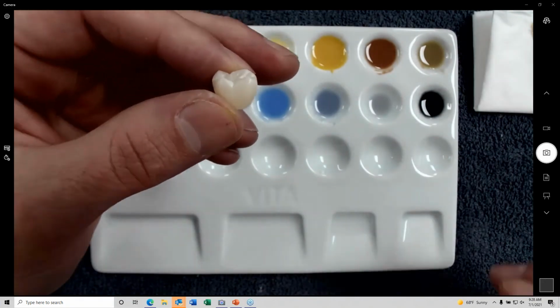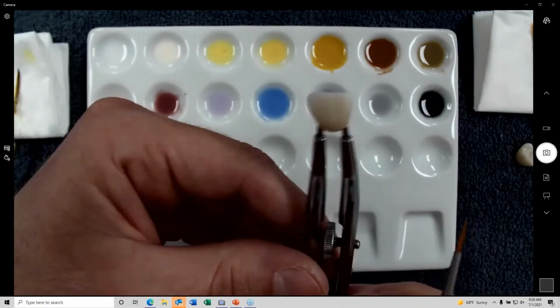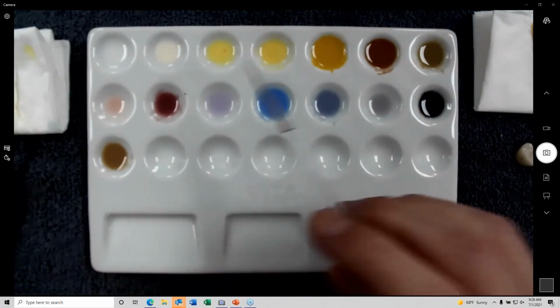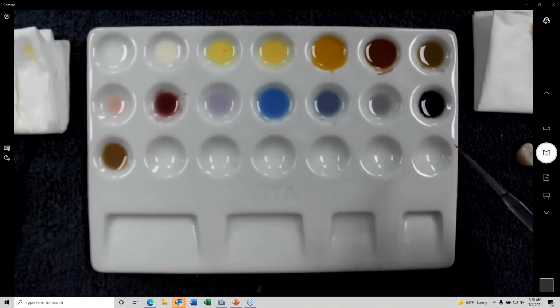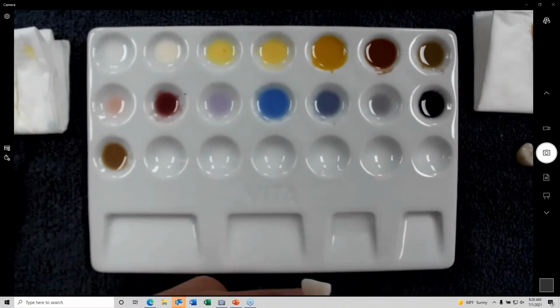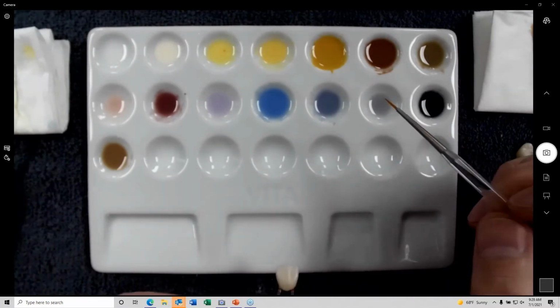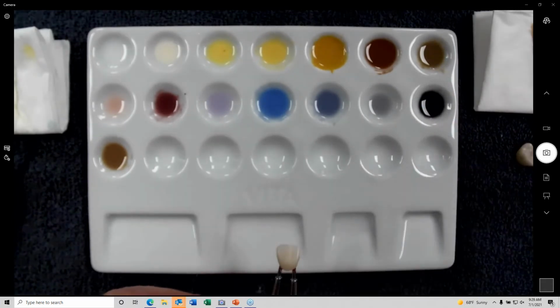It's very important. So, staining a crown, with our stain kit here, and you can see this is our Accent Plus stain kit, and we've got lots of different effect colors here. I don't usually use most of them, or a lot of them. I've got a few that I really like, and I only use the ones that I need to.